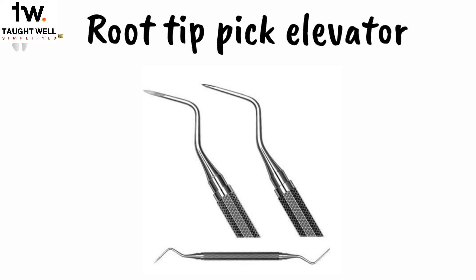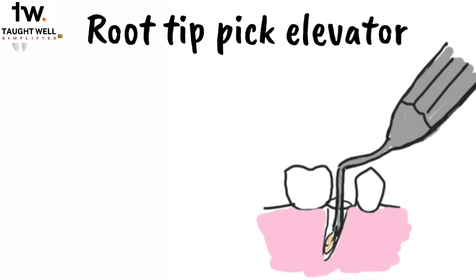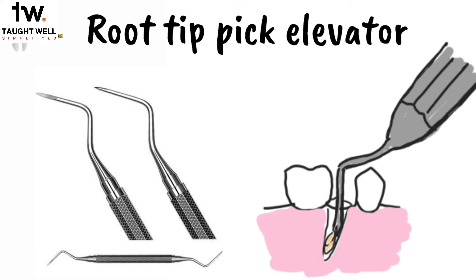The second type of pick is the root tip pick elevator. They have two angles, making them double-angled elevators. You can see how they have a delicate and sharp tip. Using this elevator, we can remove small root tips from the socket. However, since the tip is very fine, we should not use this elevator with the wheel-and-axle or lever principle, because it can break the tip. It's only used to tease very small root tips by inserting the tip into the periodontal ligament space between the root tip and the socket wall.